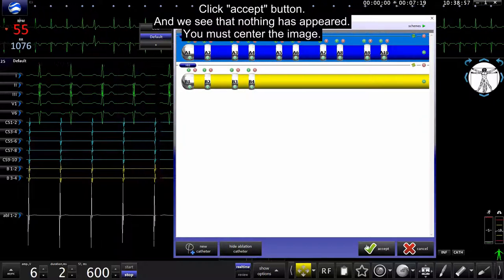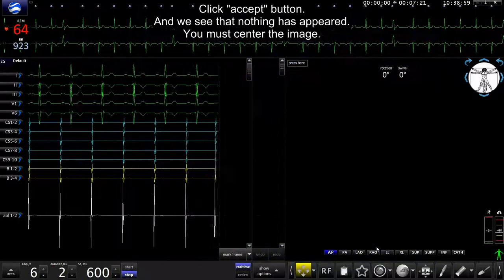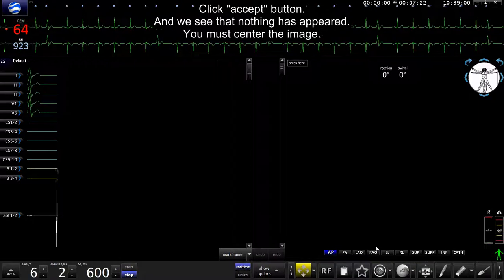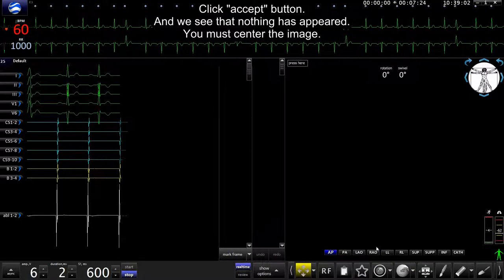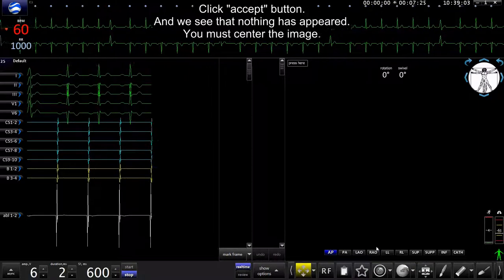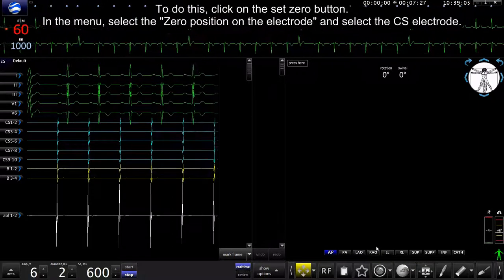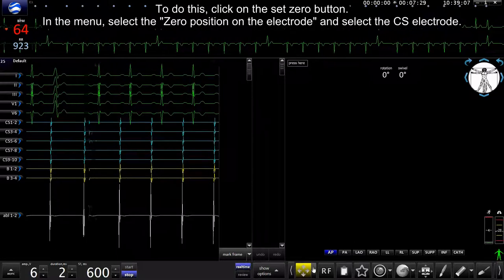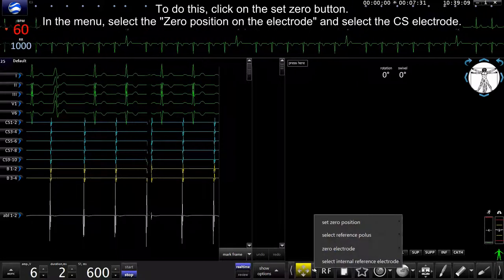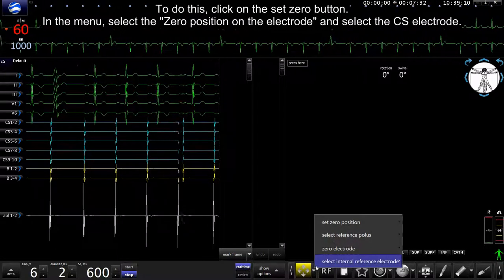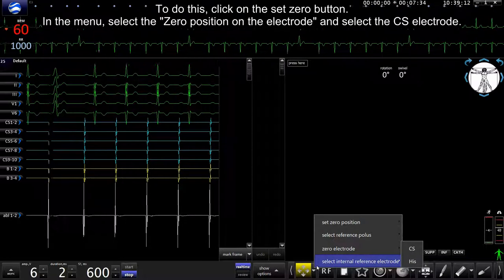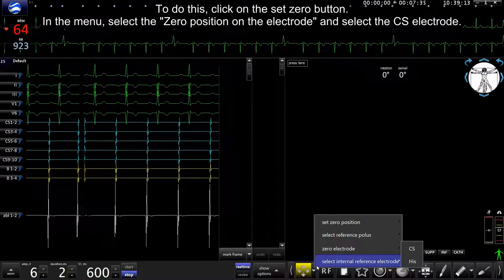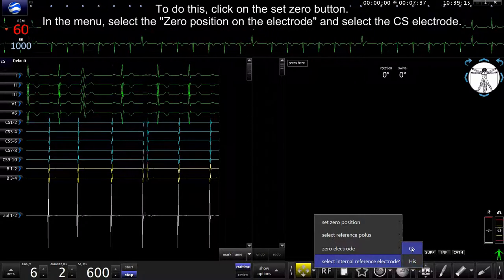Click accept button. And we see that nothing has appeared. You must center the image. To do this, click on the set zero button. In the menu, select zero position on electrode and select CS electrode.